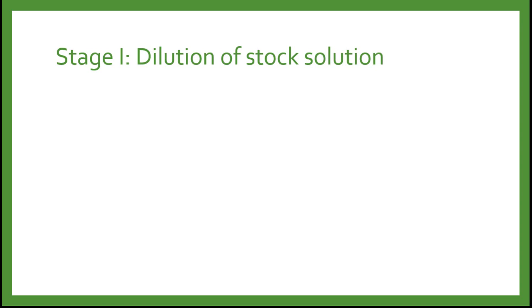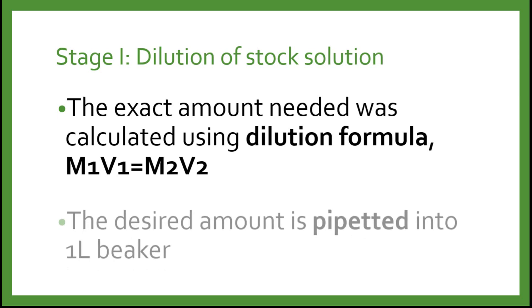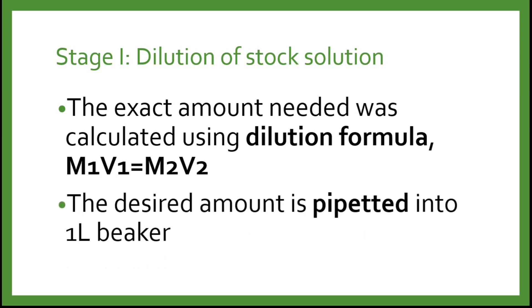Stage 1 of the media preparation is the dilution of stock solution. The exact amount needed is calculated using the dilution formula M1V1 = M2V2, and then the desired amount is pipetted into the 1-liter beaker if you are preparing 1 liter.